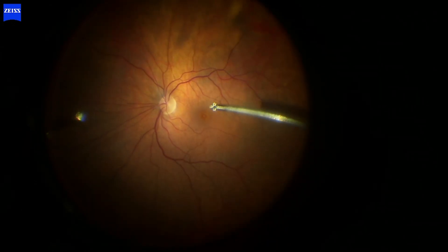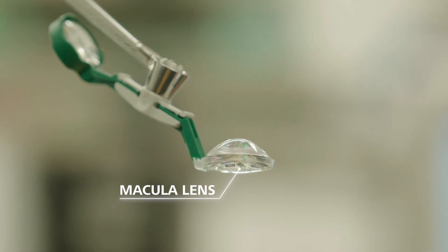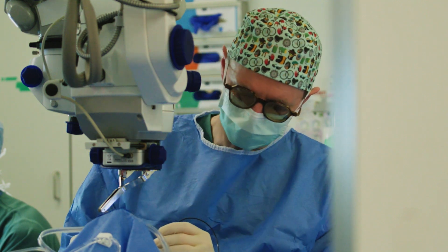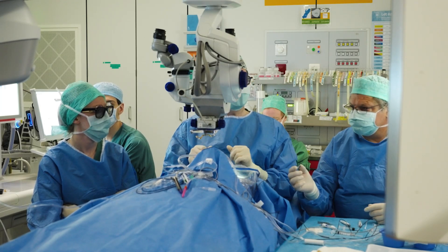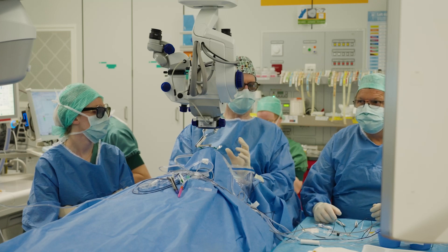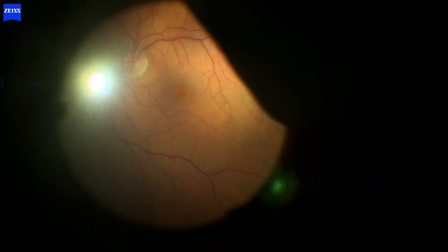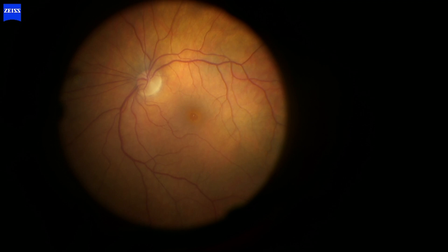Let's continue with the core vitrectomy. We're done removing the vitreous, so now we can handle the macular hole. To operate on the macular hole, we want to use a larger magnification and so we will use a different lens system. With the previous 60 diopter lens, your field of view was somewhat limited, and you didn't always see where your instruments are in the eye — you could inadvertently touch the retina. Here you get an idea of the image quality and field of view with the traditional reusable 60 diopter lens.